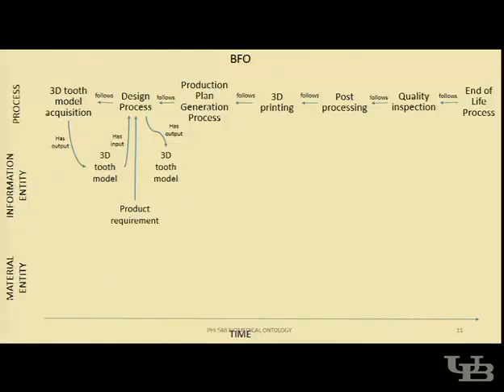For this product requirement, you don't have to set it, but you need to refer to it, for example the engineering drawing or the technical drawing. But for the process parameters, for example if you want to run the machine, you have to specify the speed of operations, the layer thickness of the operation, and so on.